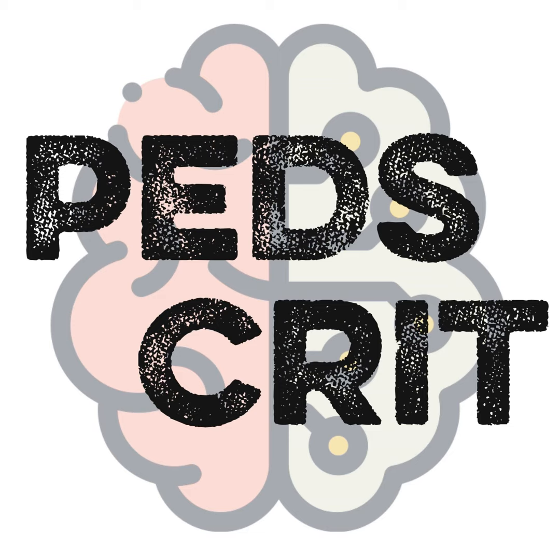Interestingly, different toxidromes, when they come with significant hypotension. Most recently, we had a kid in the unit where we had to place her on VA-ECMO for that. In the neonatal world, you could have other indications. Primarily they could be respiratory, like PPHN. It's a common one, meconium aspiration syndrome, but sometimes the RV dysfunction is so significant that they may need VA-ECMO. Those are some of the common indications for VA-ECMO.